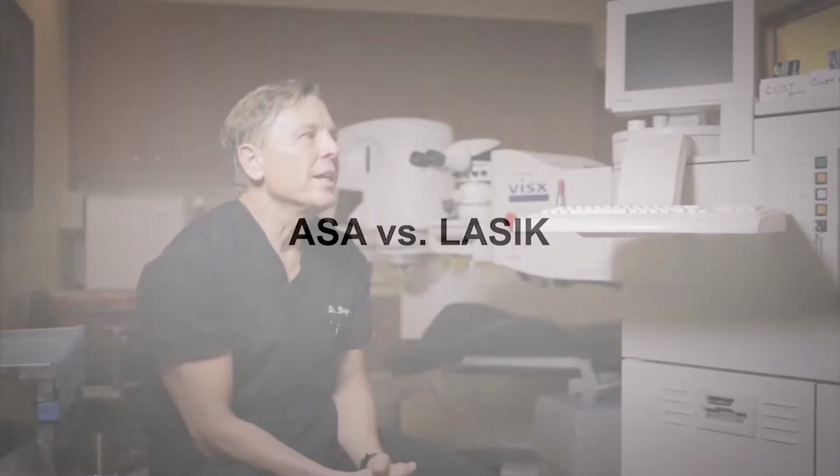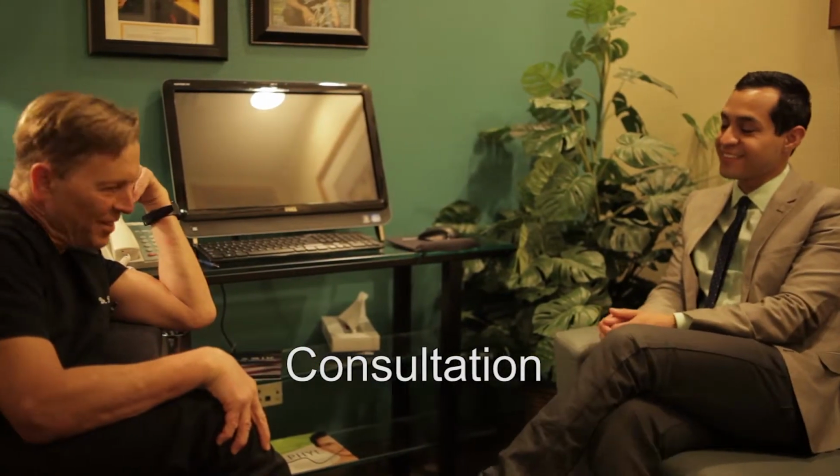So LASIK is a procedure where we make a flap on the eye. The good news is that our technology has advanced so much that the entire procedure is bladeless. It's done with lasers. How safe and how effective is LASIK surgery? Okay. You're how old now?